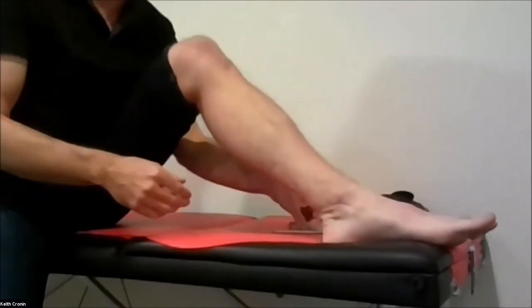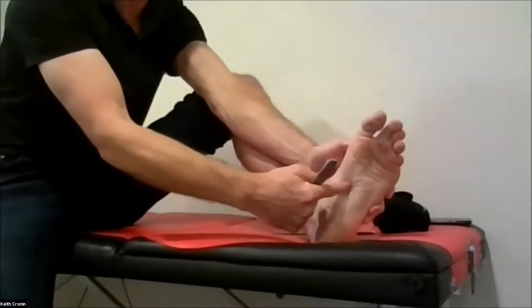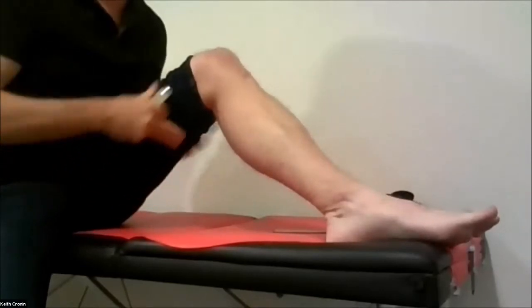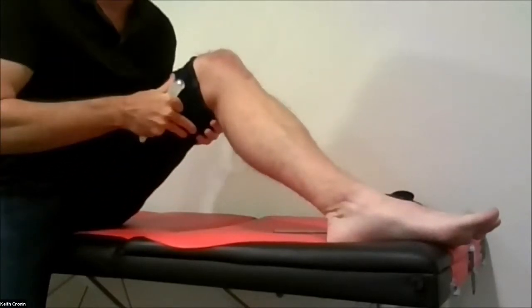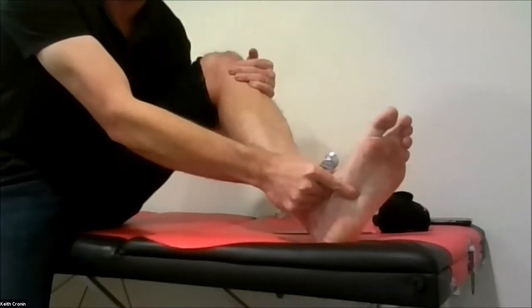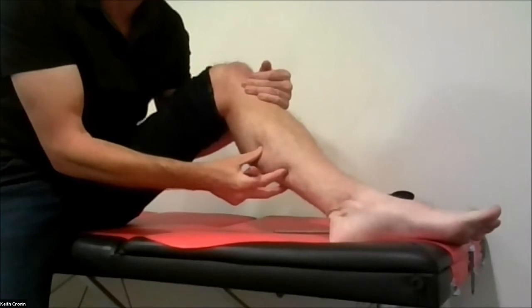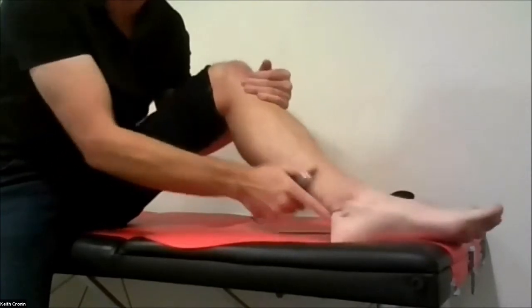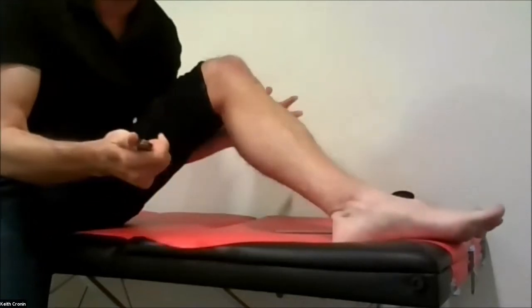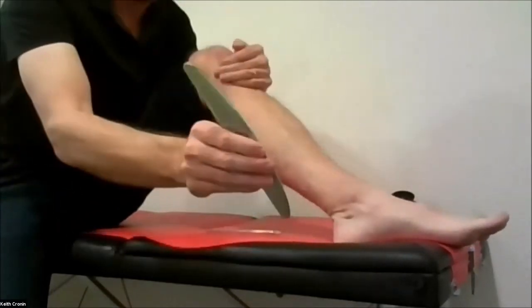So even using the tools, you say, oh, well, I have plantar fasciitis and it hurts here. Okay, wonderful. But the issue is also up through the entire kinetic chain. So we can't just look at this. This could be a captured nerve right here. This could be something where they have a lot of tightness in the soleus as well as the gastroc, and it's causing impingement of nerve all the way down. It could be tight tissue here, but it also could be weak. We don't know that. So what we want to do is first start with our tools.